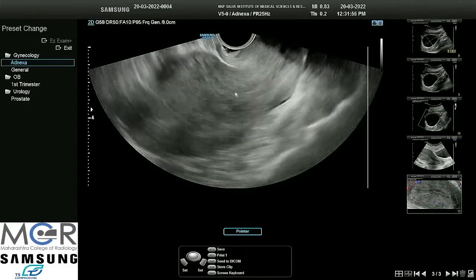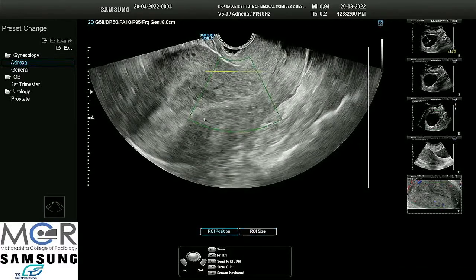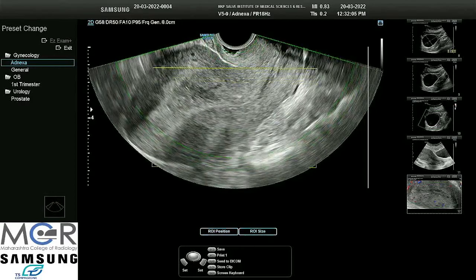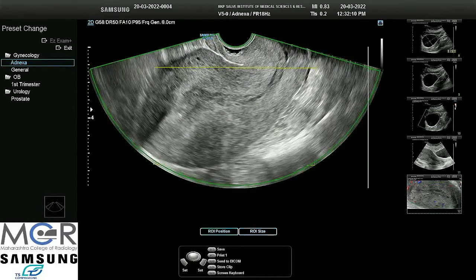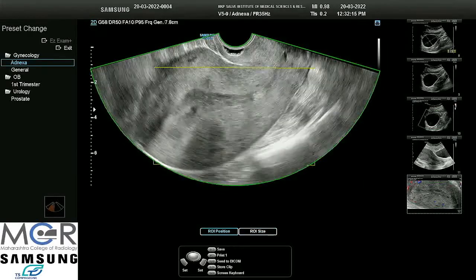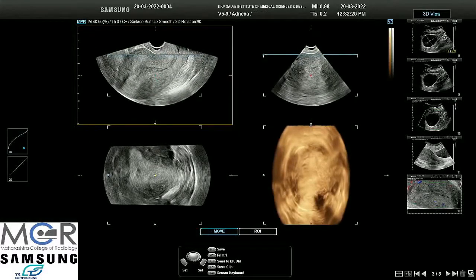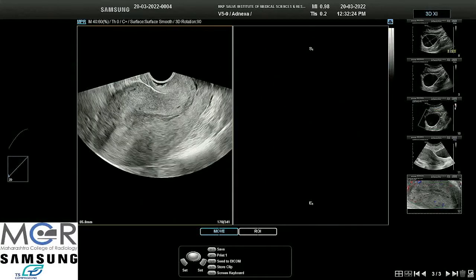If we do a 3D scan of this patient, we will be able to make out things more clearly. I am just trying to take a 3D of this uterus. We are observing here that the myometrial thickness on either side has increased and the echo texture has altered.